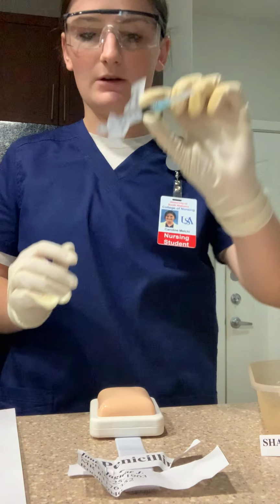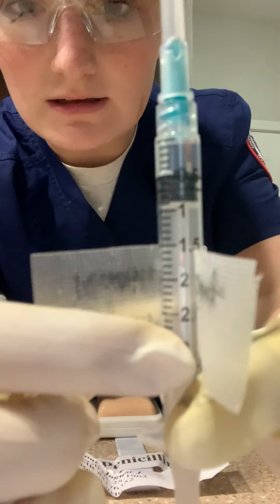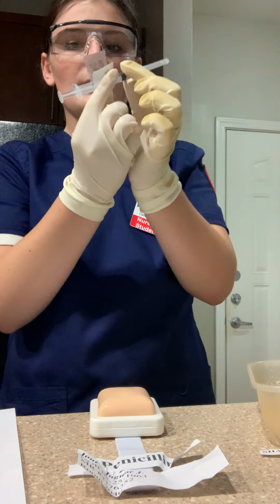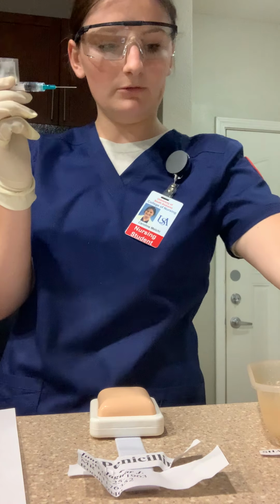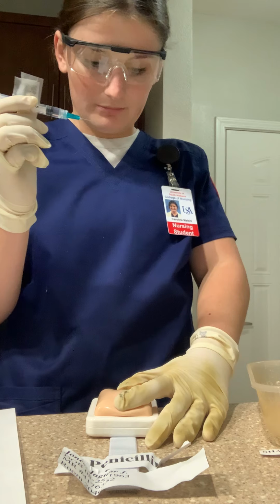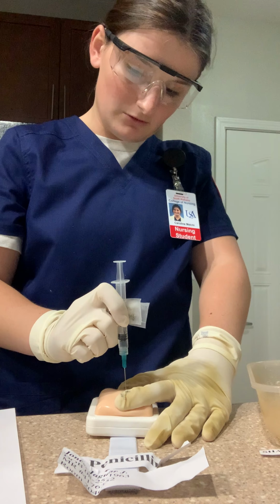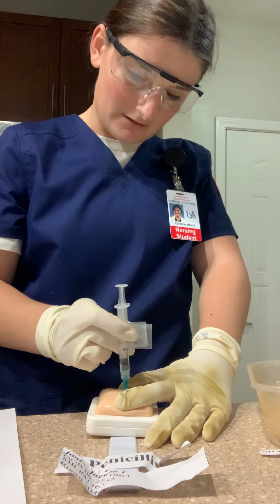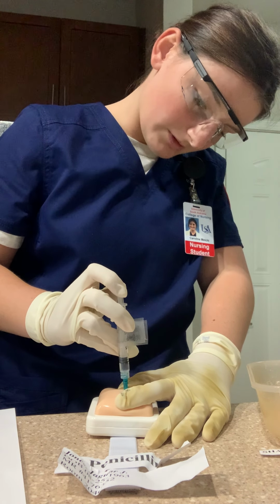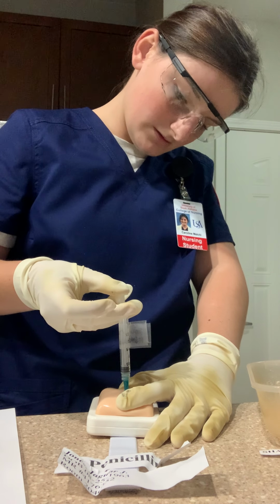So I'm going to take my needle. I'm going to uncap it. I'll show you that it does have 0.5 milliliters in there and no air bubbles. I'm going to pull the skin apart, like pull my fingers apart without touching the center. I'm going to go in at a 90-degree angle, straight down. I'm going to aspirate for blood, no blood, and now I'm going to inject. Still pulling apart on my fingers.